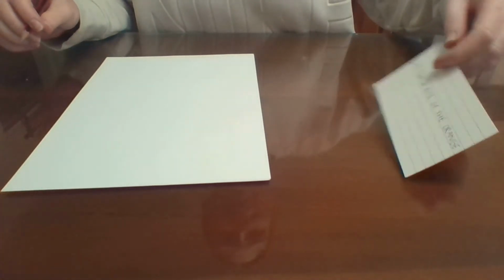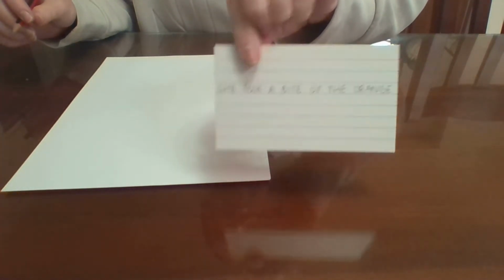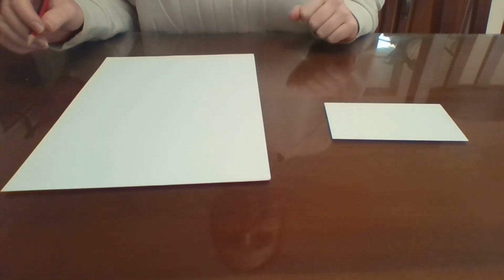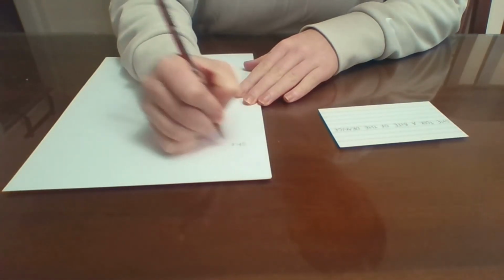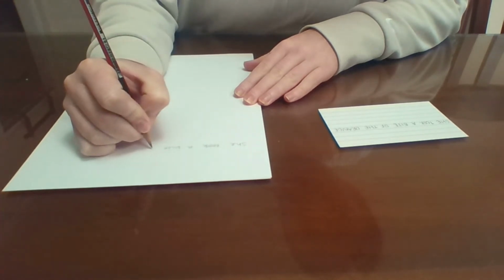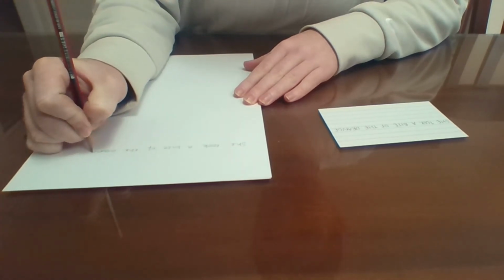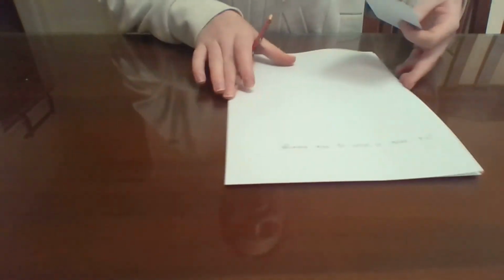There is an index card placed in front of the participant with a sentence on it, consisting of 24 letters and a third grade reading standard. The card is flipped over so the participant cannot see what is written. The assessor will say, "Go," flip the card over and begin timing, while the participant begins to write the sentence with their non-dominant hand first. The timer stops once the participant lifts the pen off the paper on the final word. This assessment is then completed on the dominant side in the same manner with a different sentence.